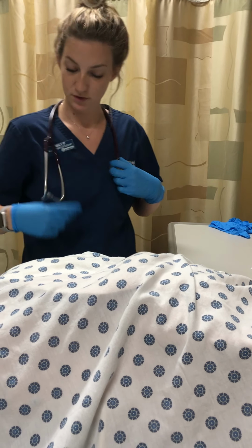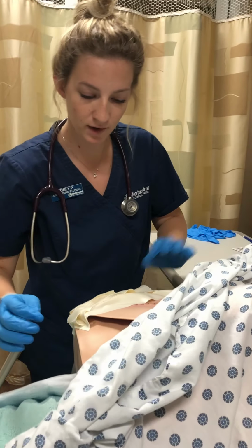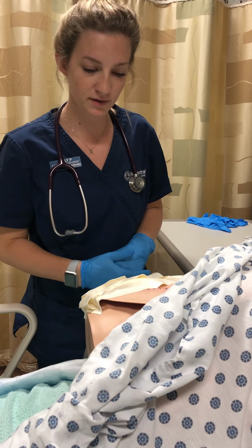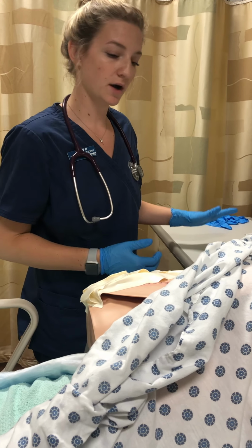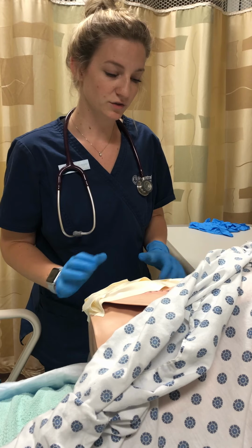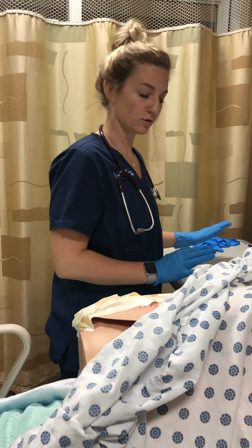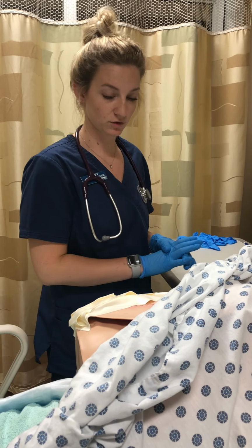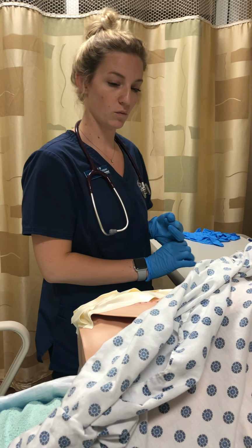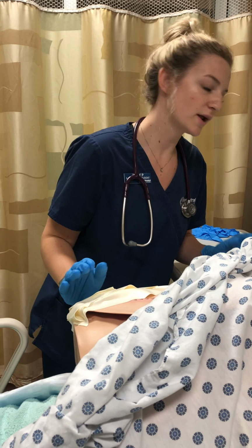Then I'm gonna go ahead and I'm just gonna peek at your dressing here. Looking for any shadowing, looking for any signs of infection, any pus or anything like that. I would also, if the dressing wasn't looking good, if it looked a little dirty, I have an extra sterile dressing kit over here if I needed to change that, along with a hemostat and a bottle of sterile water.